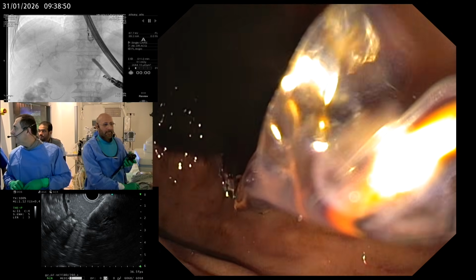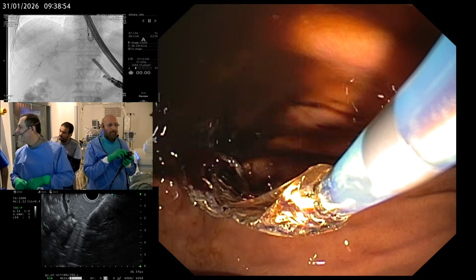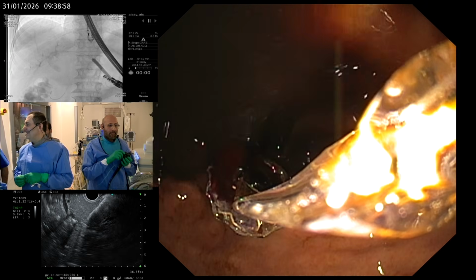Yeah. You need PTC with advanced EUS now, with a method for manipulation. No, you don't need PTC. You just need an advanced endoscopist.